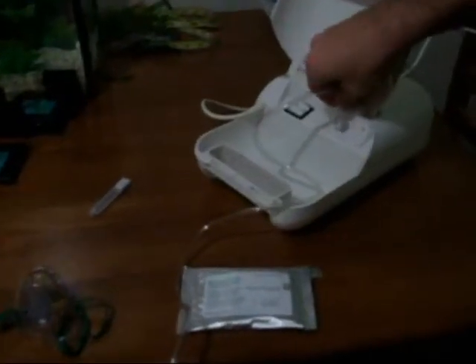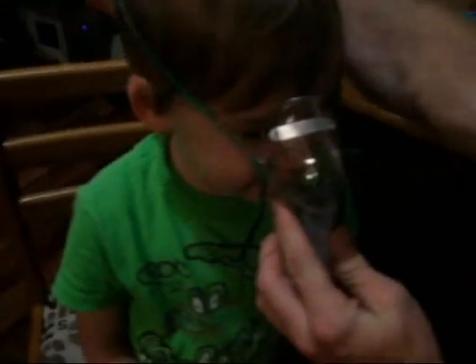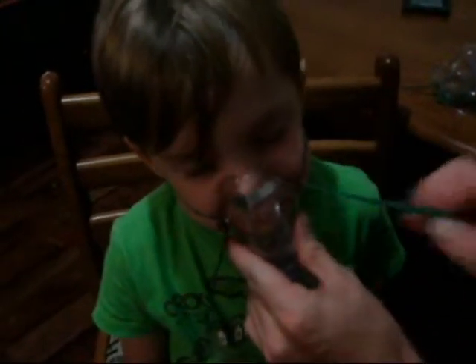Remembering to keep this canister upright to prevent spillage, attach the hose and fit to machine. The pump will ensure that the canister administers the dosage in a mist form through the mask, so attach the mask. Ensure that the mask is fitted correctly, and that the patient is comfortable.